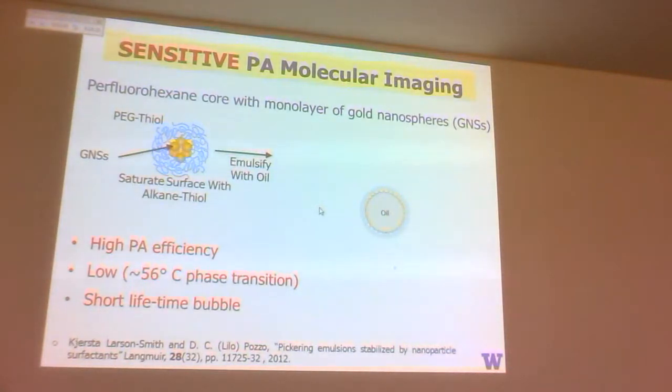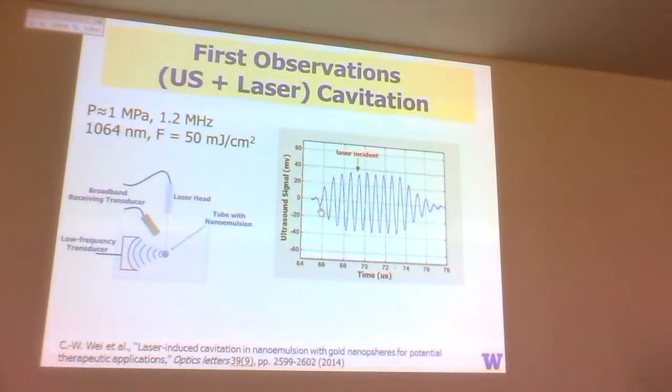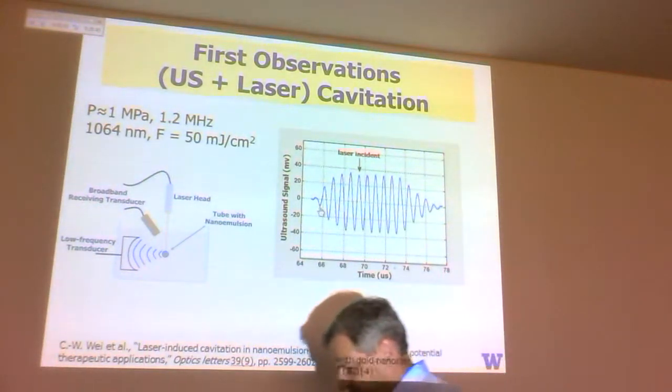And as we've worked on the last couple of years, we can tune this system so that it's perfectly reversible. So there's an expansion, and then there's a recondensation into the liquid, and there can be some loss, but very, very little in this, and so you can actually continuously image that expansion, that nonlinear expansion. And then here's the last trick, which really made this thing practical.